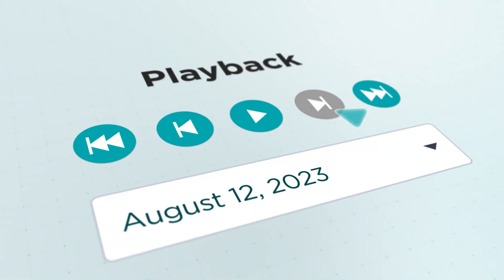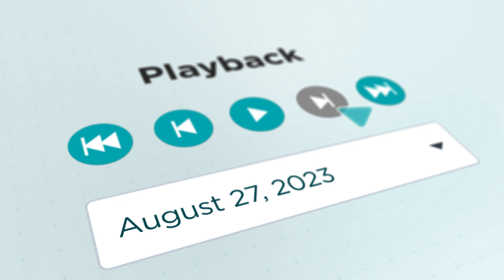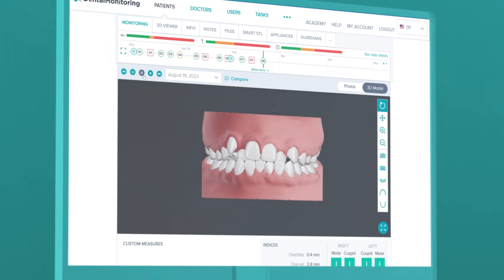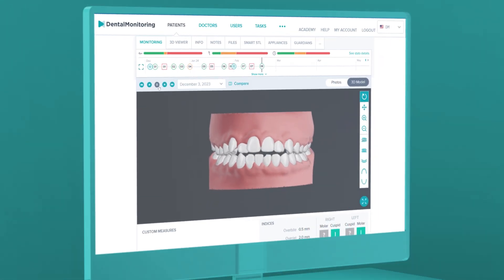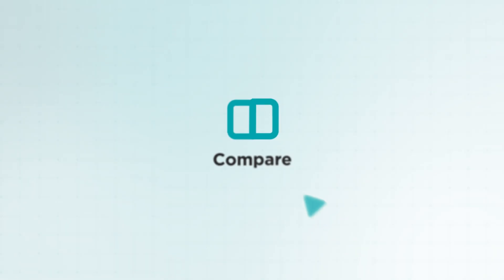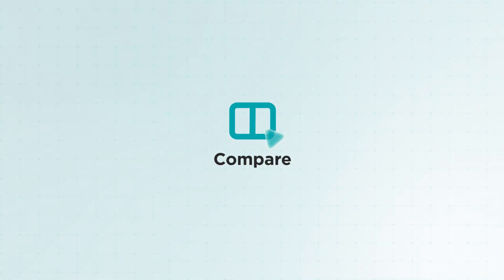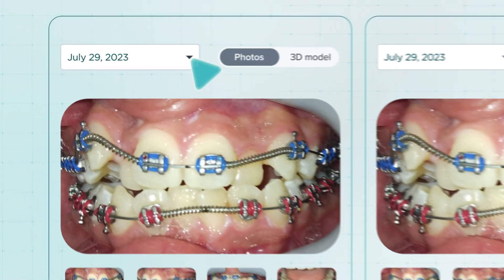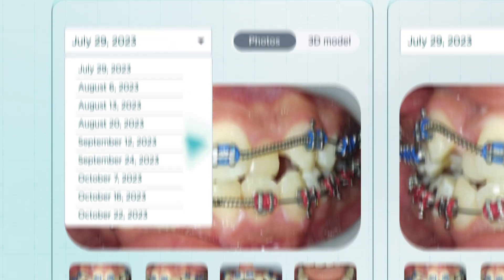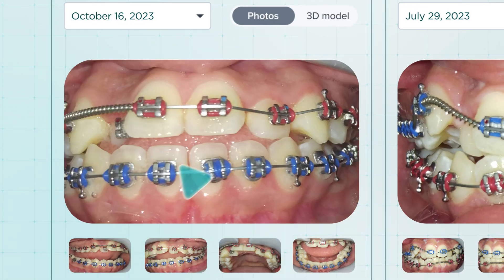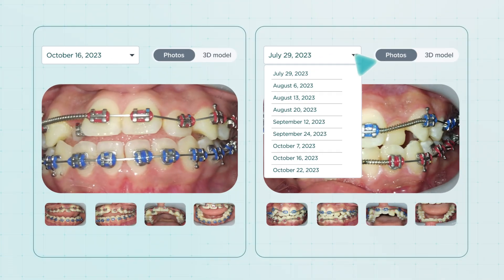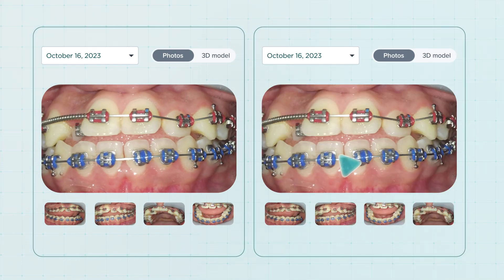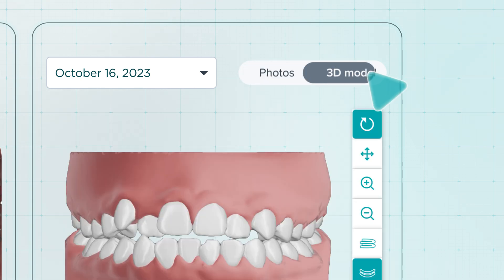With this advanced feature, you can track progress in dental monitoring like never before. Compare different stages of treatment within the flexible and precise 3D environment.